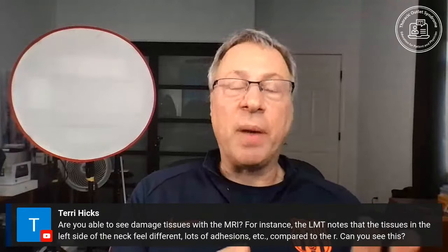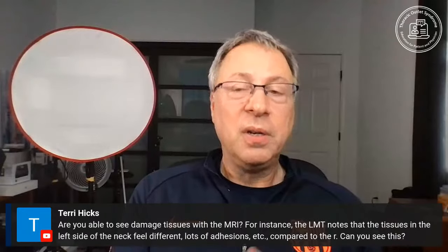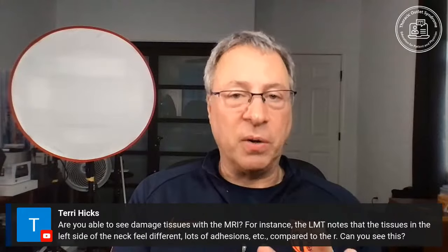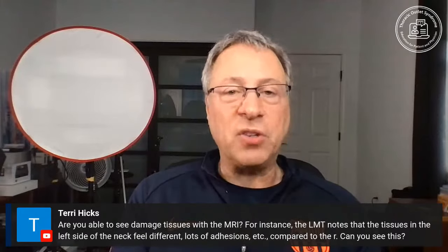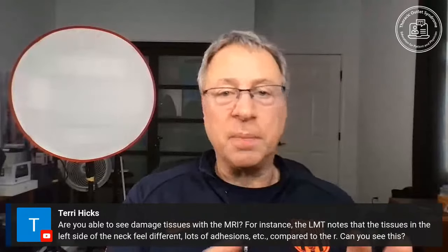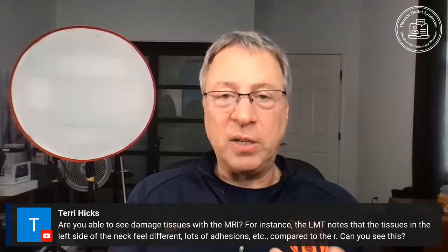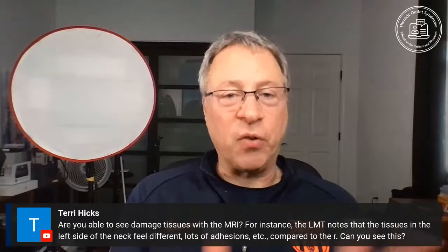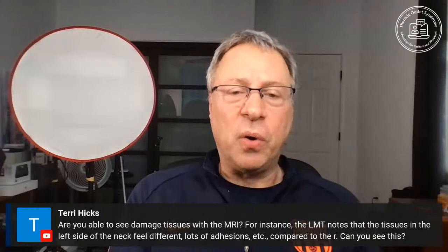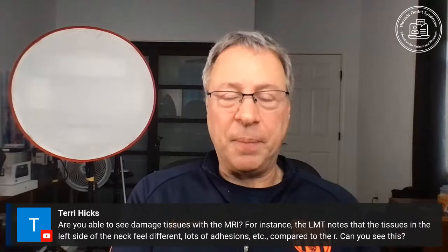So from electron microscopes, we know that damage to the muscles can cause a change. These were in chronic patients, granted, not just from a one-time injury. We don't know exactly what happens in patients who get a sudden injury and then recover. But we do know there's a possibility of these soft tissue changes. Now, MRI doesn't have the resolution of electron microscopy, and it's not intended to do that. So we can't see the inner structure of a muscle, for example.